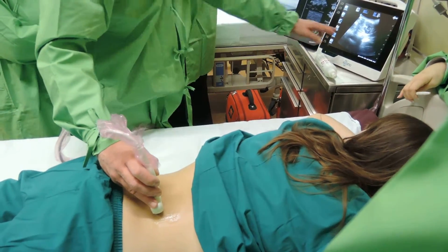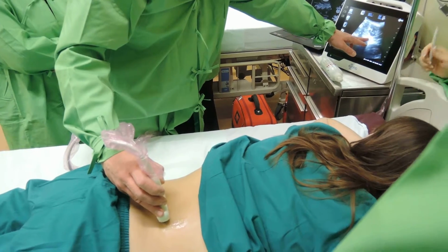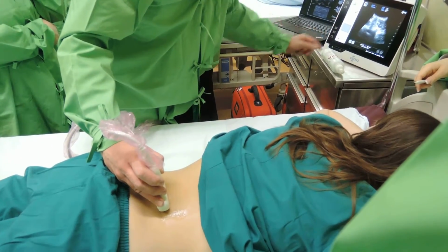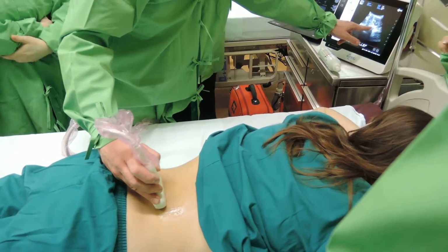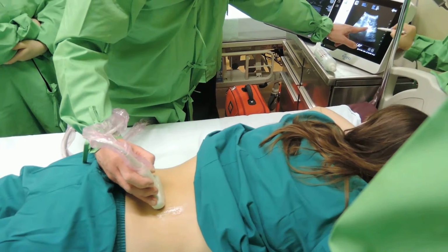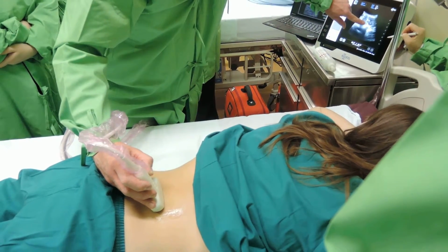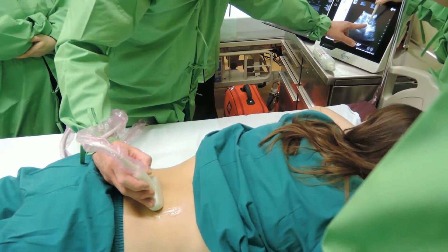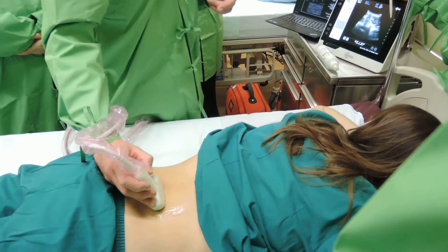And if one plays a little bit, then the articular joints appear. This is the superior articular process, and this is the inferior articular process, and the dark line in between is the joint.